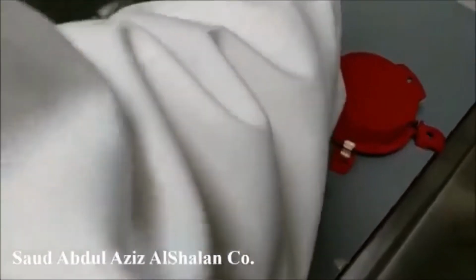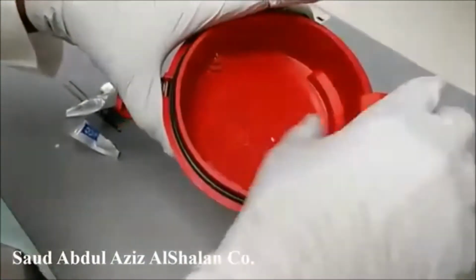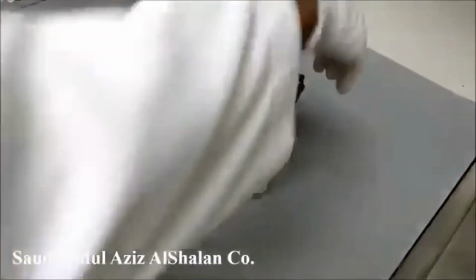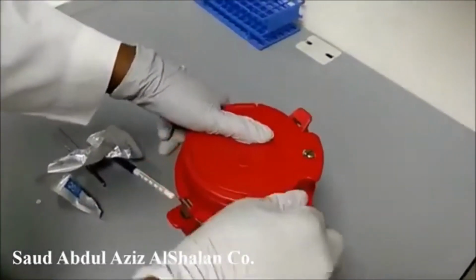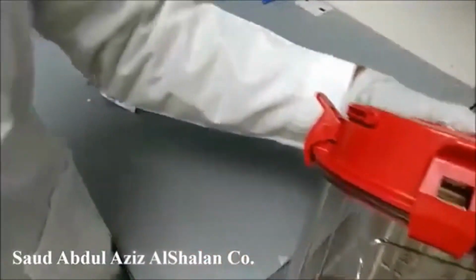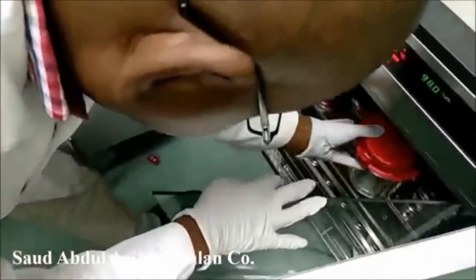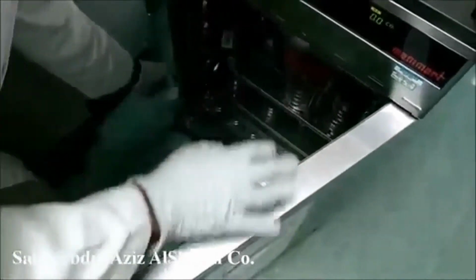We will put this on and close our jar, and we will incubate it at 37 degrees for 7 days. Now we are done with the processing.